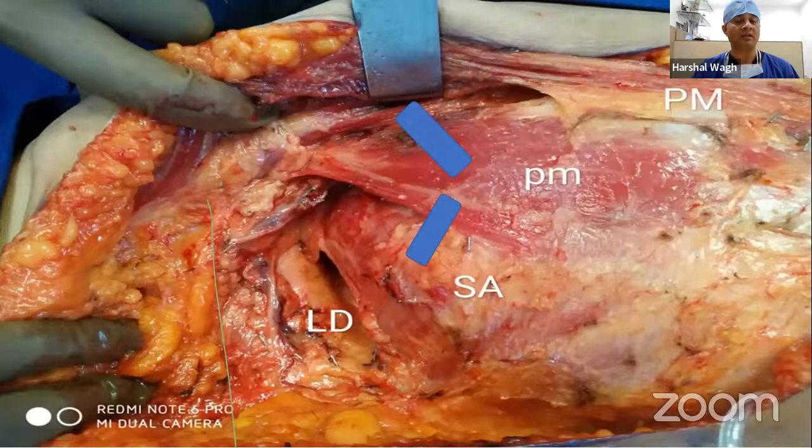As I move more laterally, before I meet the LD, I'm going to see only serratus anterior and the ribs, and I'm going to see the pleura below. So that's what my probe position is going to be.